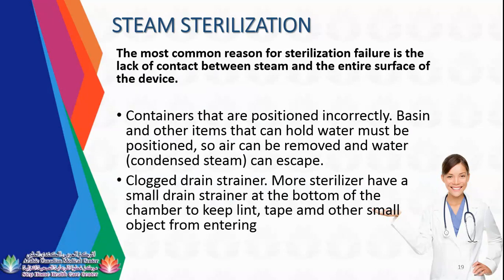Containers that are positioned incorrectly: basins and other items that can hold water must be positioned so air can be removed and water can escape. For example, the handle of your kidney basin should face the paper side of your pouch. If you are placing a kidney basin, you need to place it on its side in the autoclave, in a standing position.